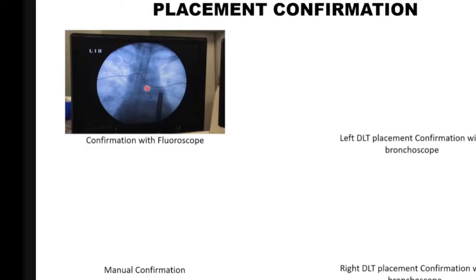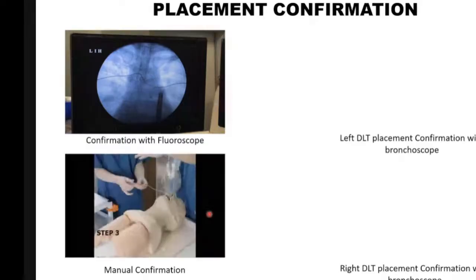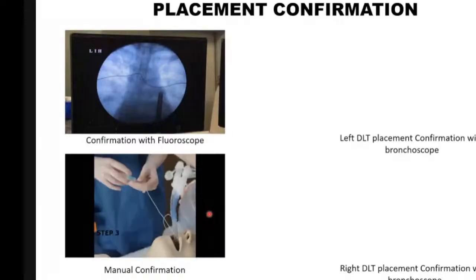Now in step 3, the bronchial cuff is gradually inflated till this air leak stops. We can check either by auscultation. Now the cuff pressure can always be measured.